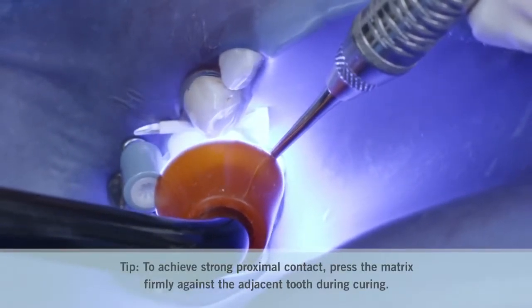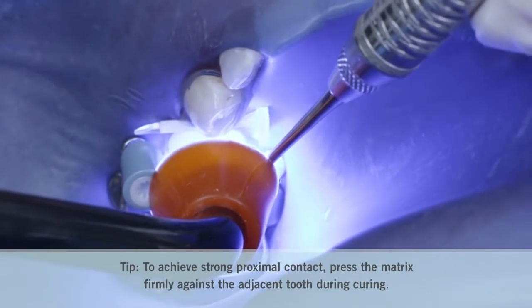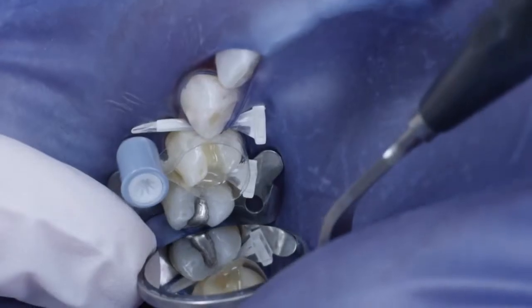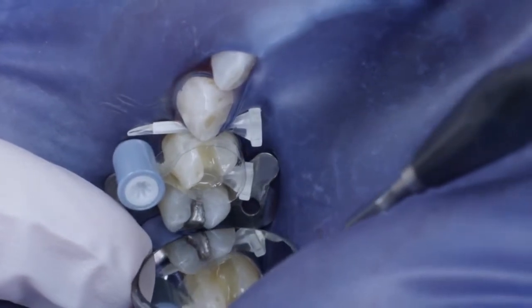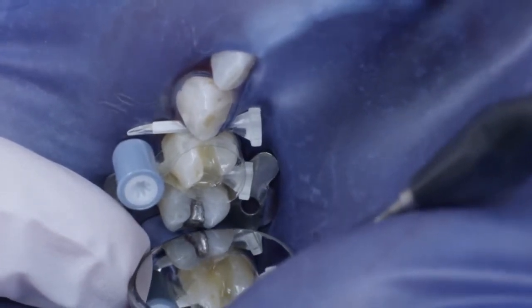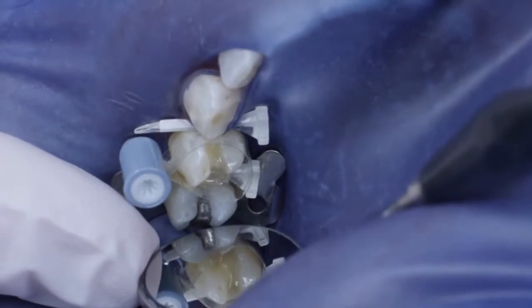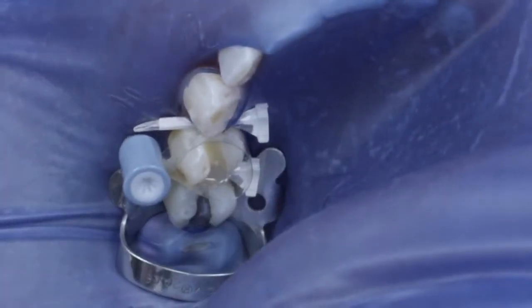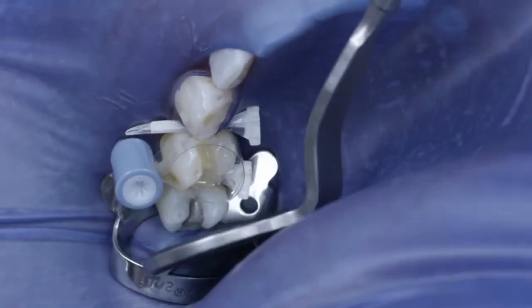In order to establish an effective contact point, I pressed the Heidemann spatula against the matrix band and the adjacent tooth during curing. After curing, the material was nicely fitted to the matrix band, and, as can be seen, there was still sufficient space for the 2 millimeter covering layer of Venus Pearl to follow.